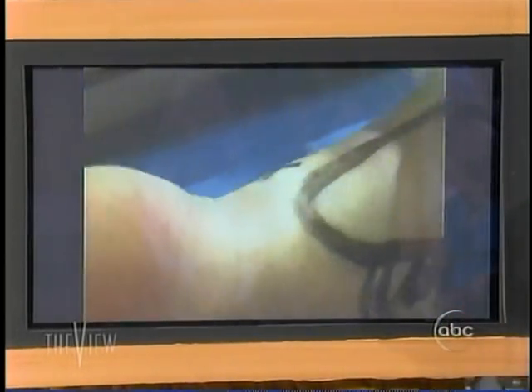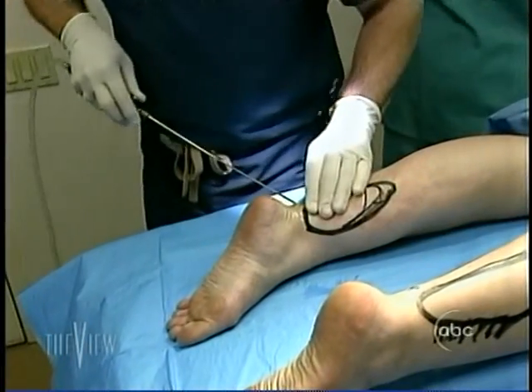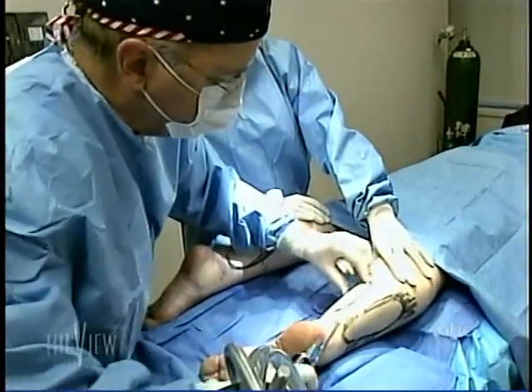So you're not taking out muscle? Just extra fat. Okay. Absolutely. And then we use the power liposuction cannula just to suction out the fat. That is a sensitive area on the leg. It is, but you get great results after. The skin is much smoother.